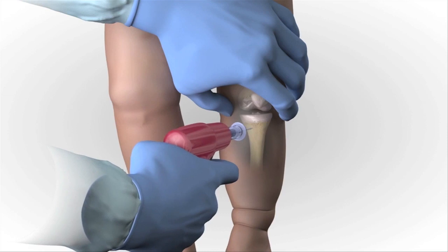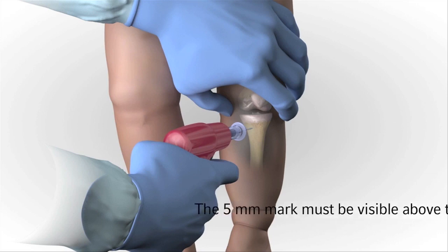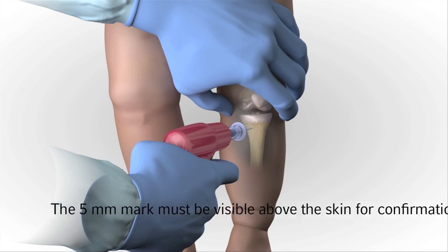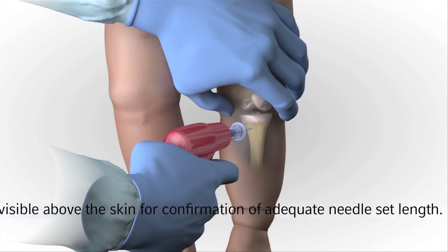Push the needle set tip through the skin until the tip rests against the bone. The 5 mm mark must be visible above the skin for confirmation of adequate needle set length prior to drilling.